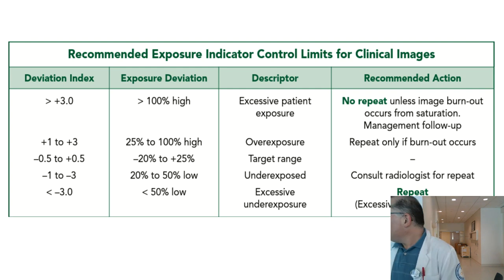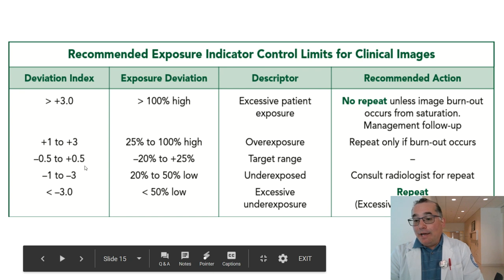What's the difference? 0.51. Does our range not cover? Yeah. Like 0.6? Yeah, that's a good question. I guess that would be somewhere in between these two, right? Like 0.6, 0.7, 0.8, before you actually get. So that's probably still okay. Especially since this says negative 20 to 25, I guess it leaves some margin where the numbers aren't completely exact. But yeah, that's a good point. But if you did get a 0.6 or 0.7, again, you wouldn't be repeating.